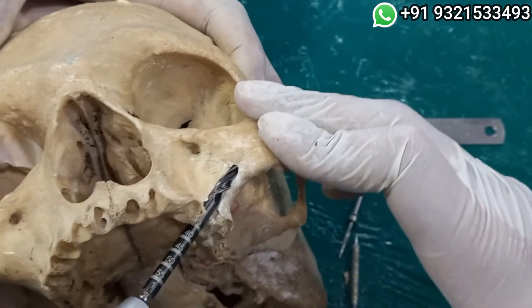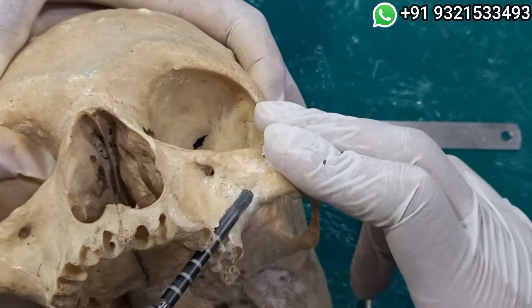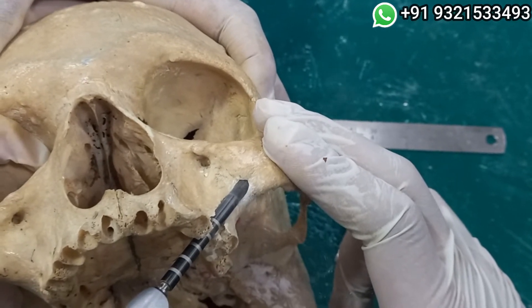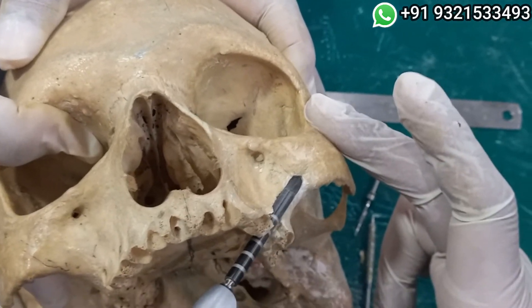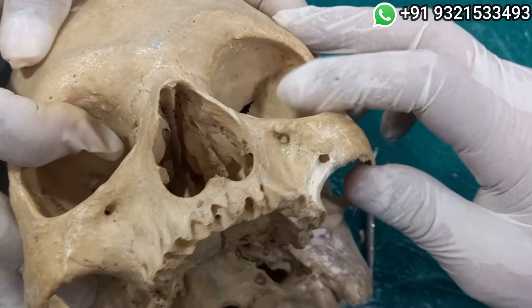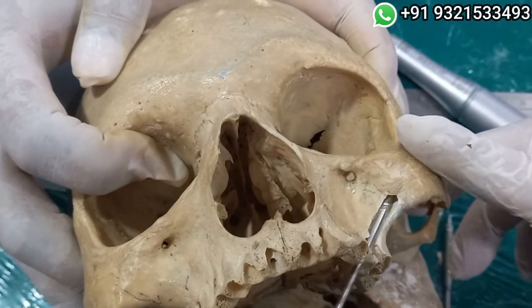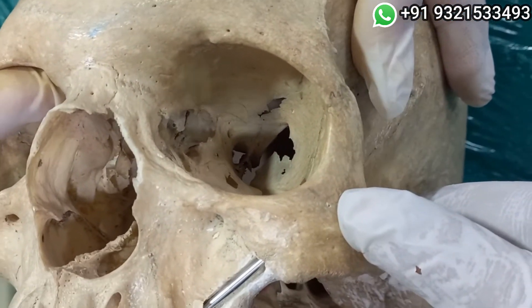Now this slot is guiding — there is no way anything is going to go wrong. Too much heat is getting generated; we are in the meat of the zygomatic. And if you see very carefully, you can see a nick has come here.